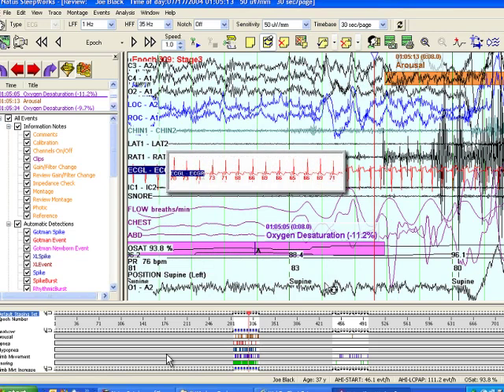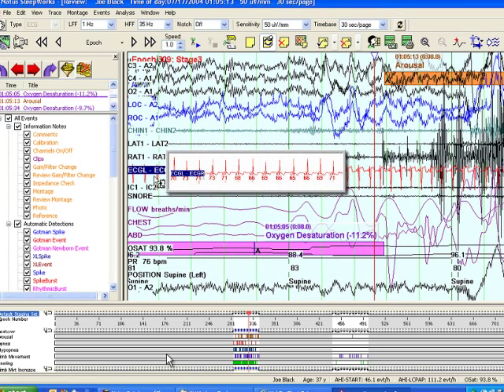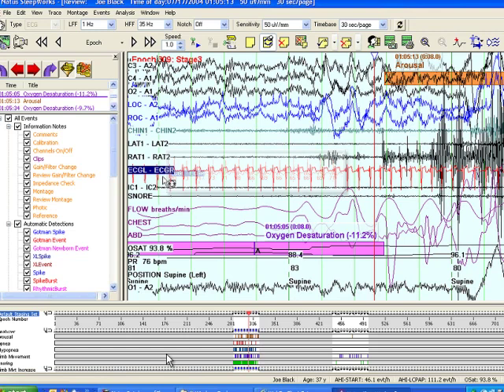All right. Now, you'll notice here, I just clicked on display heart rate values. It didn't show anything. And that's because the heart rate analyzer, you cannot run this after the fact. So it's different from the other analyzers. If you didn't run the desaturation analyzer, the arousal, any of the event tag ones, if you didn't run it during acquisition, you can always submit them for analysis after the fact. You cannot do that with the heart rate analyzer, and you can't do it for the breath rate analyzer. These are real-time analyzers which need to be enabled.